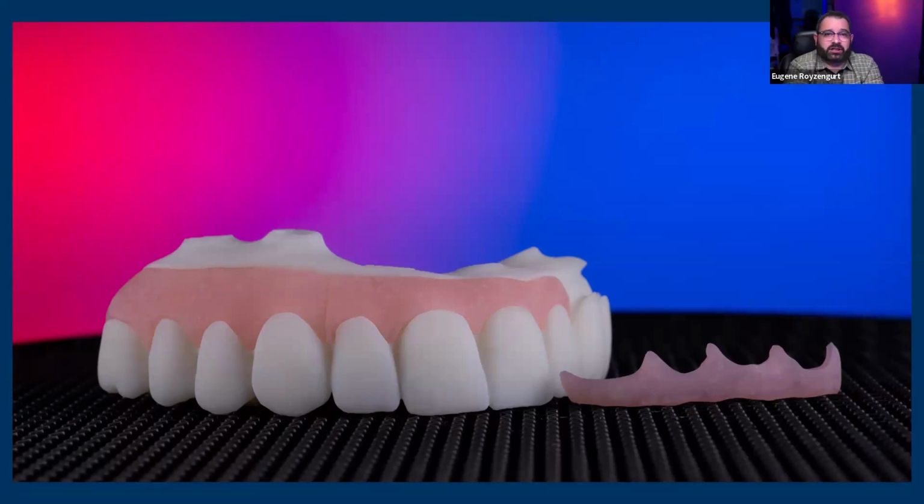Obviously, there are some hygiene issues for a lot of people, especially with prototypes. So you'll see some staining, but I'm not seeing a lot of breakages. I'm seeing really good wear resistance, and for prototypes, I've been really happy with it. But basically, from here, instead of just doing a plain digital cutback, I actually split the file into two. So I had the gingival portion, and I had the prototype.